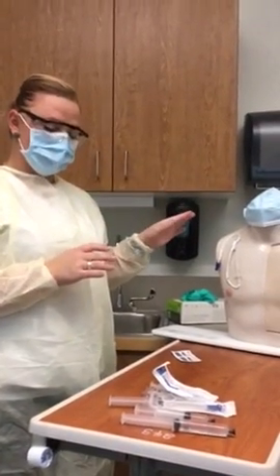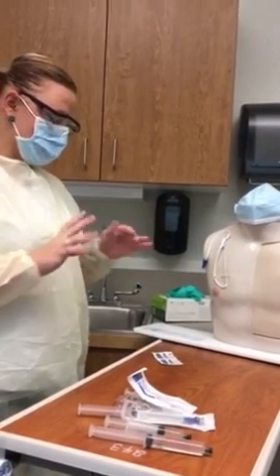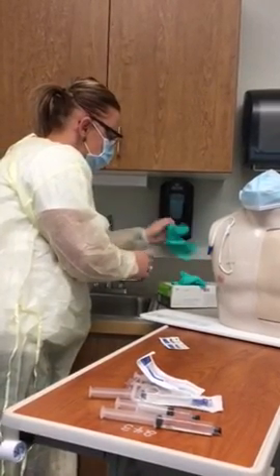So we're back for our third video, the final video of this. We're going to do a cap change and a lab draw. Like I said, I've already verified my patient. We're just going to pick up from where we left off. Make sure I do hand hygiene. I'm going to put on some gloves.